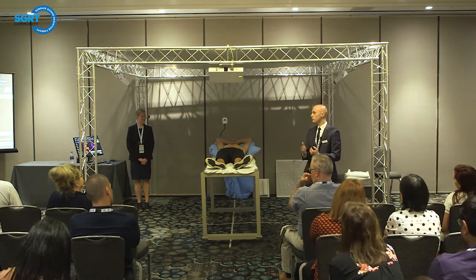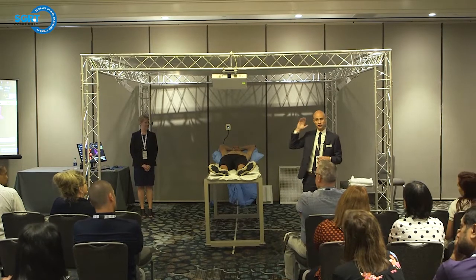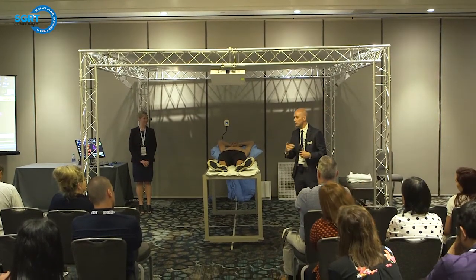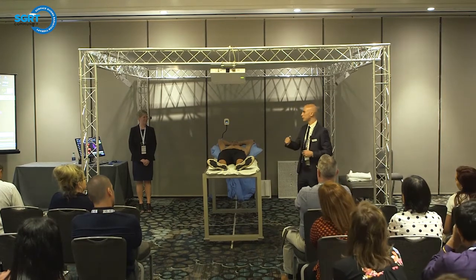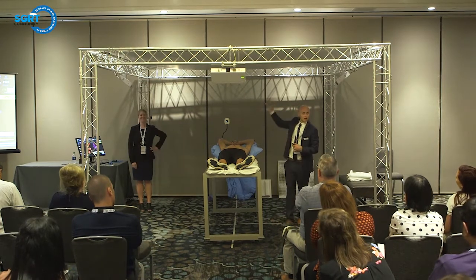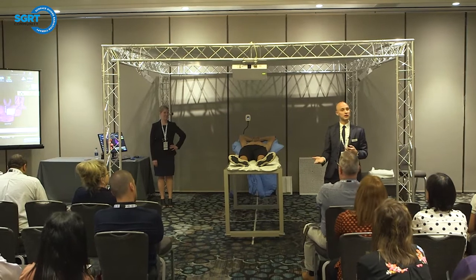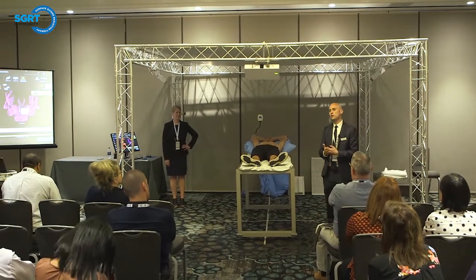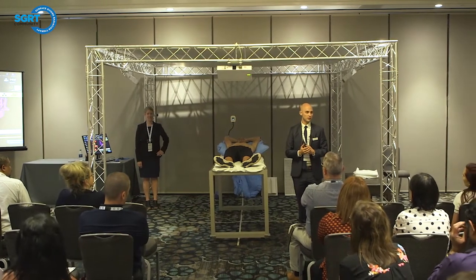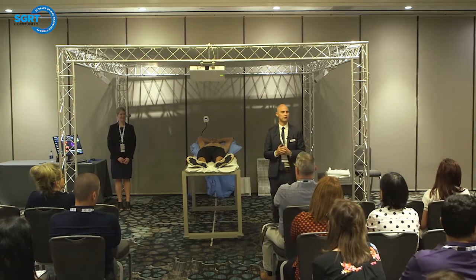I was at a site a few weeks ago, and they coached the patient, just take a breath in. Once that colored bar is on top of the white bar, we're good to go. We stepped outside of the room, and the patient took a breath in and literally put the bar on top of the white threshold bar. I didn't think anything was wrong with that, nor does anyone else, but the patient understood that a little bit differently. So once the patient understands how to use that device, you're gonna be good to go. And just that coaching too. The way you explain that is different for everyone.